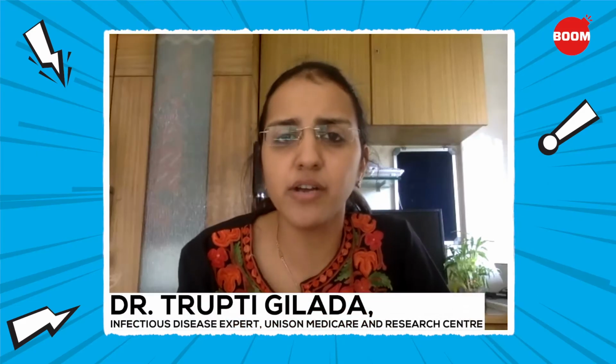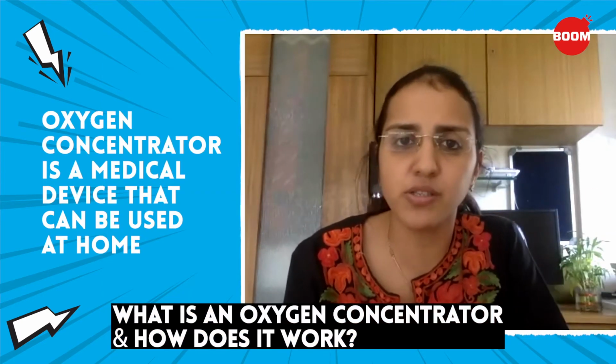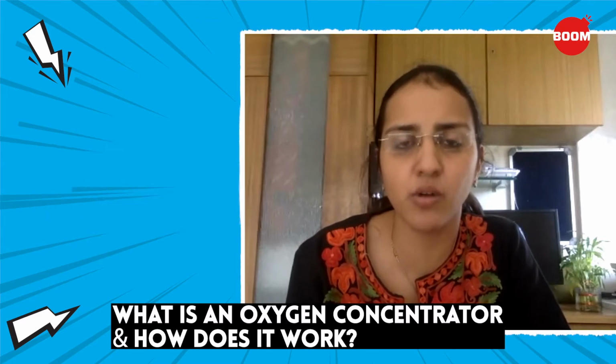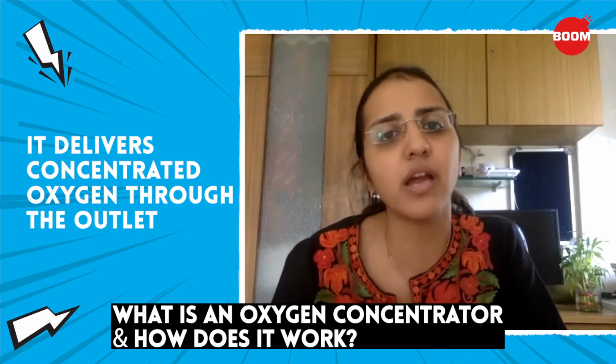An oxygen concentrator is a device that can be used even at home, which takes in the atmospheric oxygen. Atmospheric oxygen has oxygen at 20 or 21% concentration, and it extracts only the oxygen from that, concentrates it, and delivers it through the outlet.